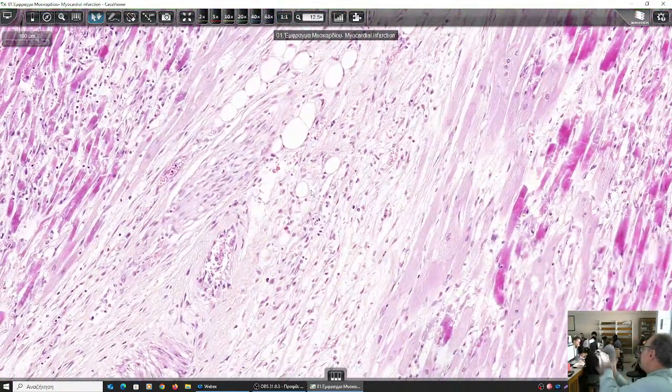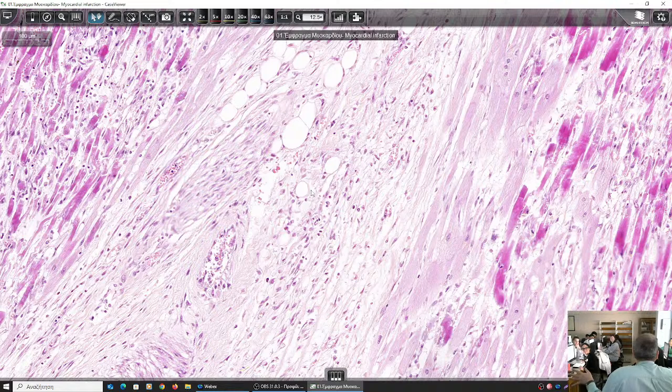So if you have this slide, the whole exam will last about 5, 6, 7 seconds. It has nothing to do with theory. I'm not interested in theory. I'm interested in identifying something. I'll say, what is this? This is scar tissue. This is the old infarct, and what do we see? We see fibroblasts. Show me a fibroblast, you show the fibroblast, and you get 2+.